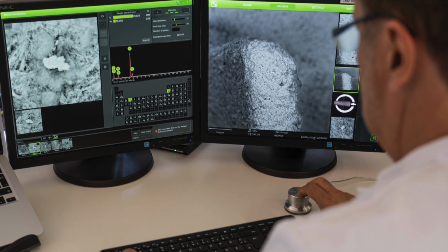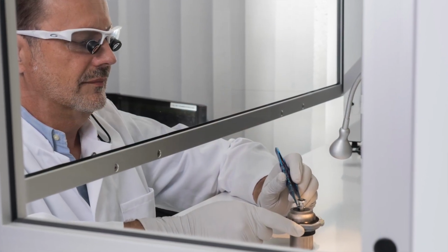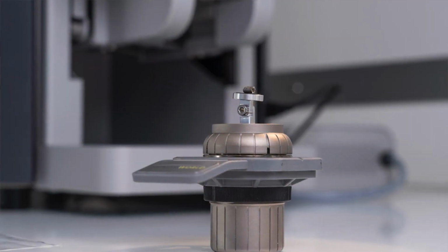Comments made by manufacturers regarding these figures focus on patients with unfavorable clinical preconditions, and even blame us, the dentists, for our lack of experience and training. Is this the whole truth? In our recent quality assessment study, conducted in collaboration with the Charité University here in Berlin, we unpacked more than 100 different sterile packaged implants in a clean room environment, including ceramic and titanium implants, and performed with these implants elemental analysis of the surfaces in a scanning electron microscope. What I found in the microscope is presumably beyond your imagination.